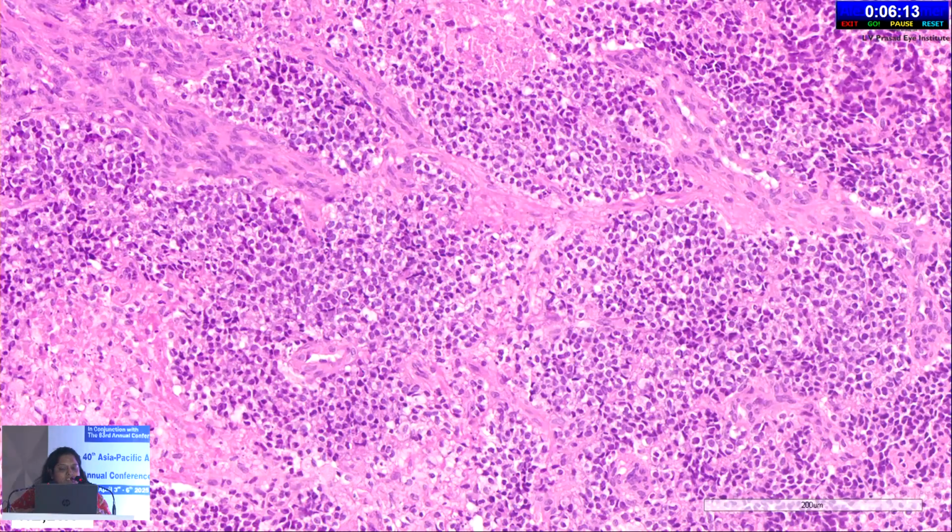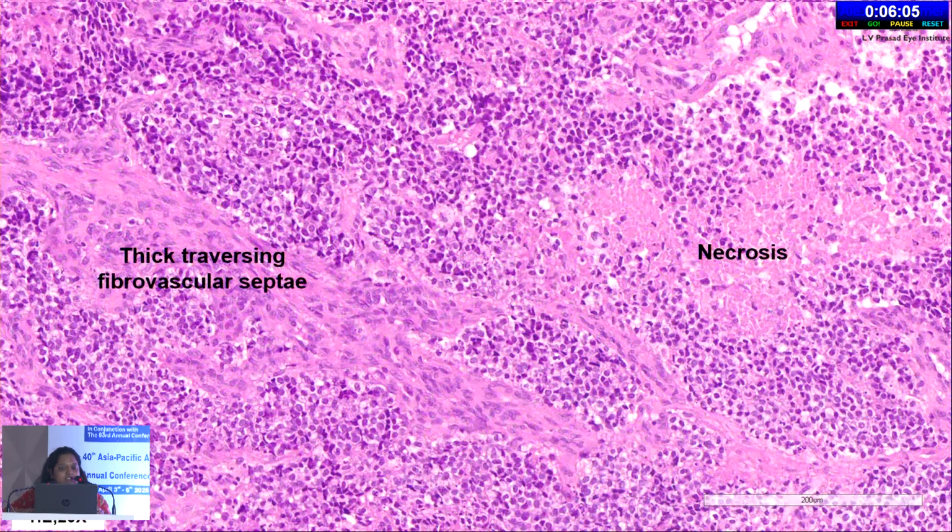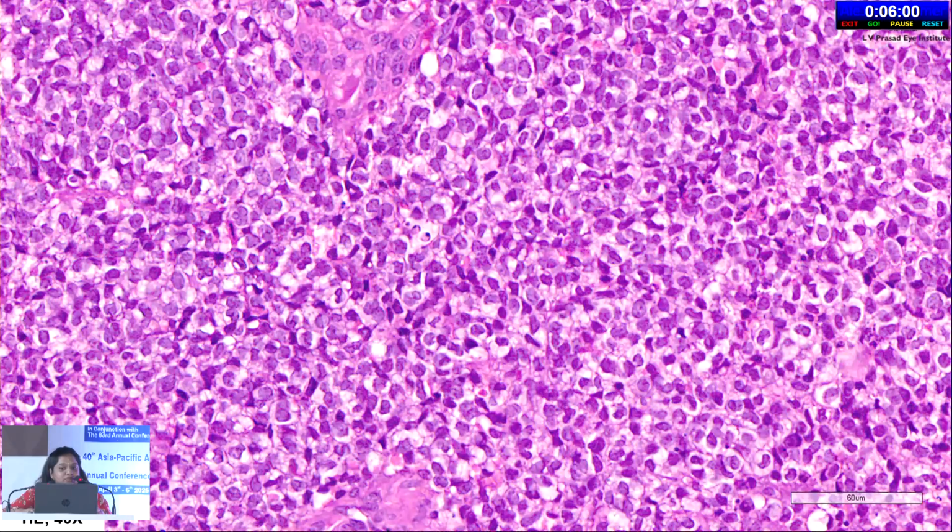So this was the HPE of the tumor, where we have a more or less monomorphous round cell population with traversing thick fibrovascular septae and necrosis. Now, the lesional cells were round with moderate pale eosinophilic cytoplasm and a round hyperchromatic nucleus. There were occasional mitoses seen.